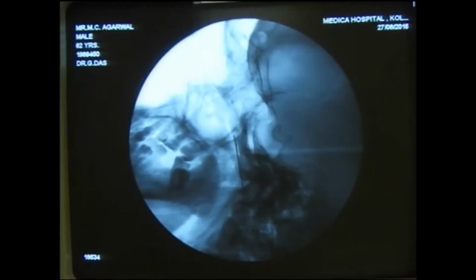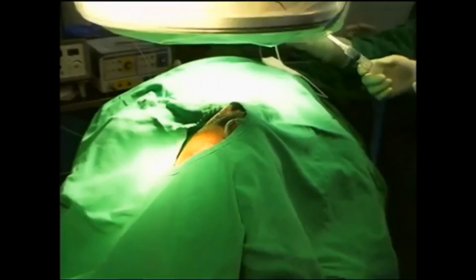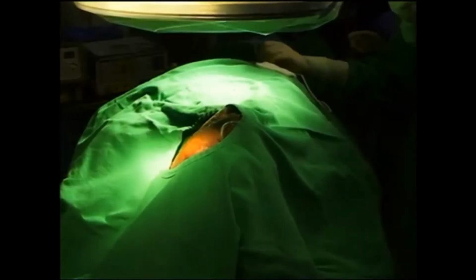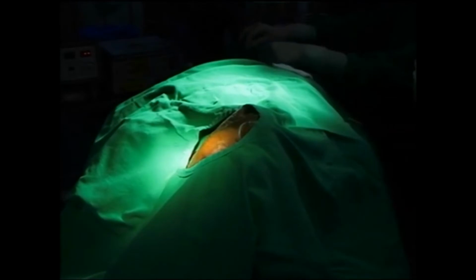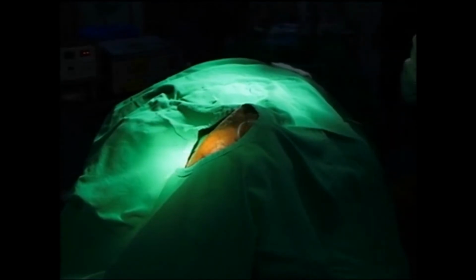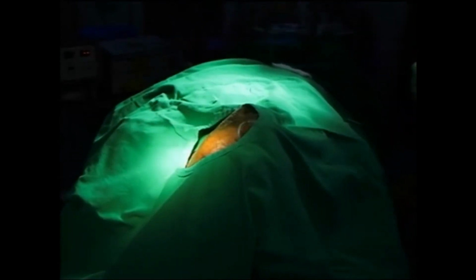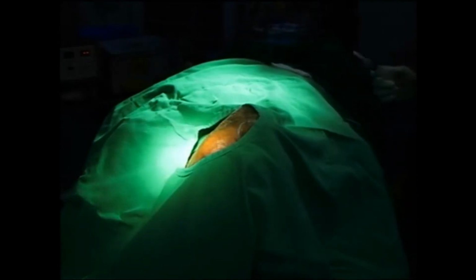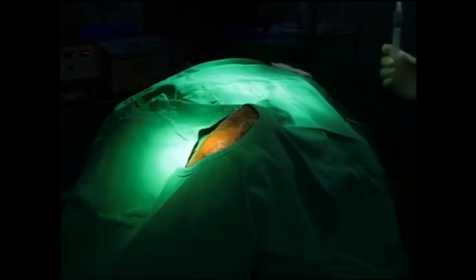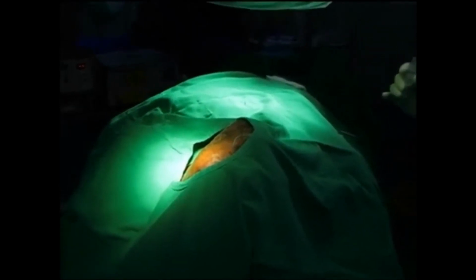Now we'll start in the same patient, under the same setting. We are going to start the trigeminal V2 RF ablation. My idea, like Dr. Jain explained, is a submental view. To get the submental view, the image intensifier is moved about 30 degrees caudal and about 10 to 15 degrees ipsilateral oblique. So you can see the image intensifier going caudal, stop, and then we'll get a view.